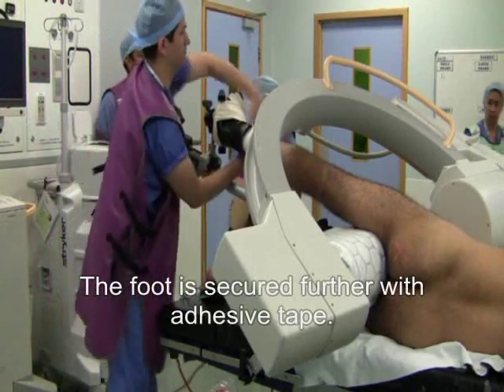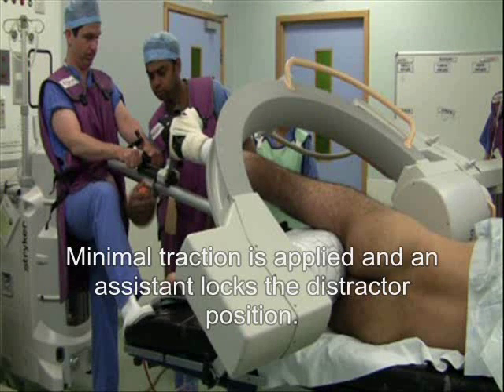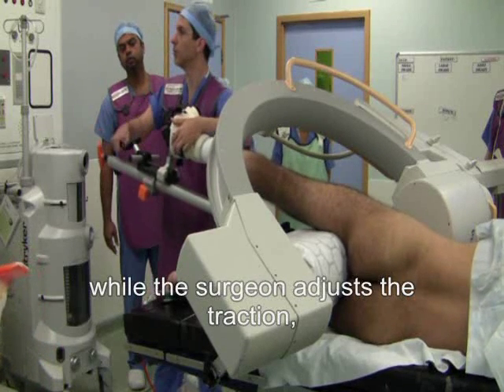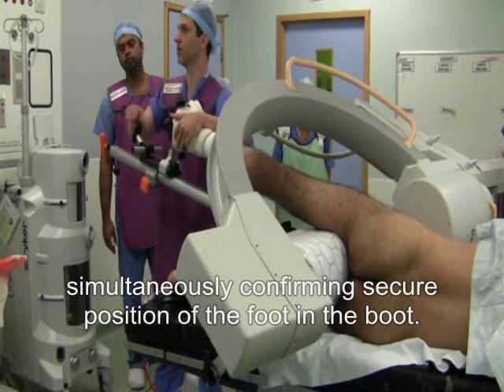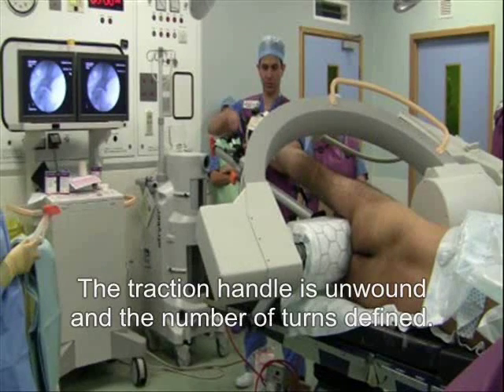The foot is secured further with adhesive tape. Minimal traction is applied and an assistant locks the distractor position. A trial of traction is performed under image while the surgeon adjusts the traction, simultaneously confirming secure position of the foot in the boot. The traction handle is unwound and the number of turns is defined.